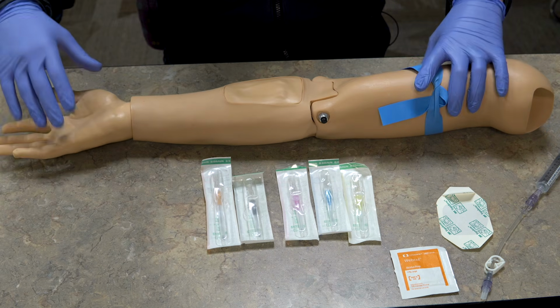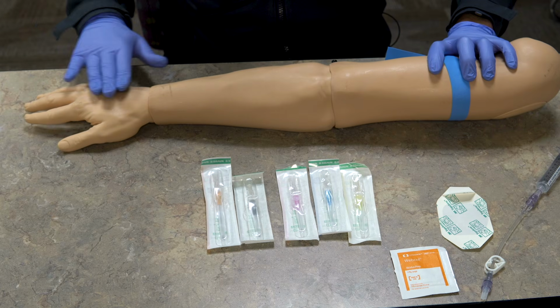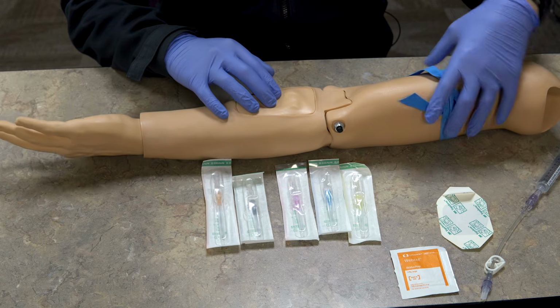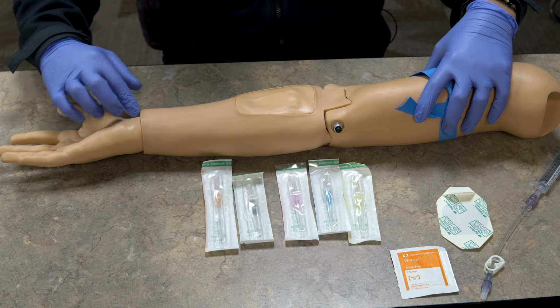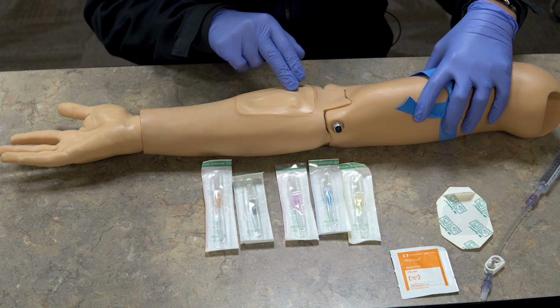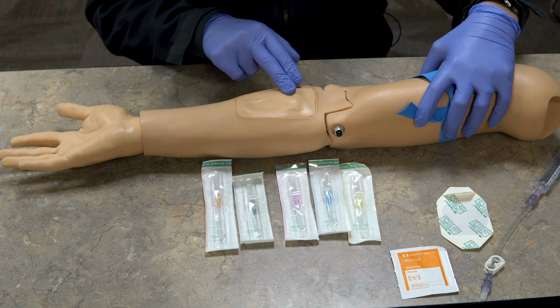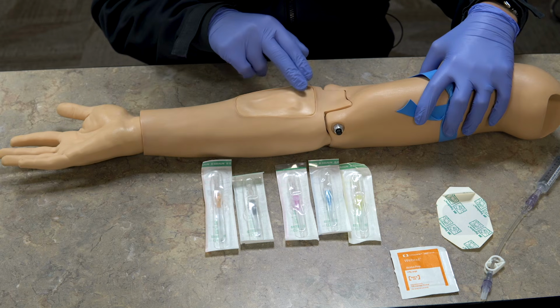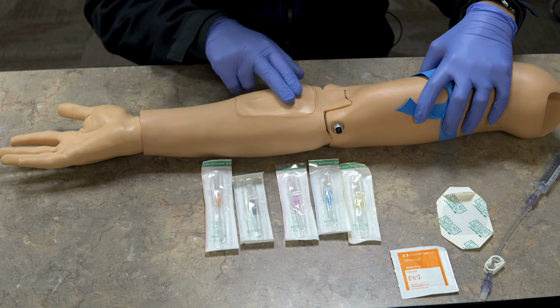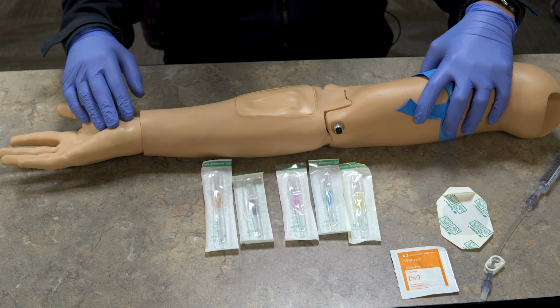Rule of thumb is you want to start distal, that means far on the arm, and work your way up. Because if I start an IV up here and I miss, and then I try to start one down here, there's a chance that those veins are connected, and if I flush fluid into that, it'll just come out of the hole we just created here. So you try to avoid that. It's not always possible, and it is technically frowned upon to do it down here, but I have missed up here and then had to come farther on the arm. It's just something you should try to avoid.